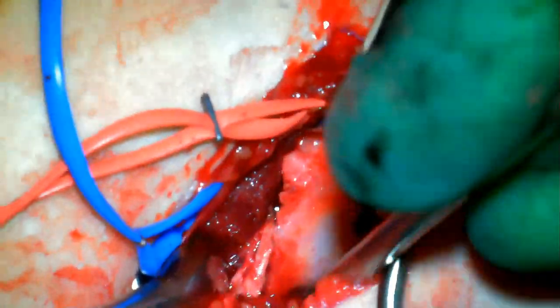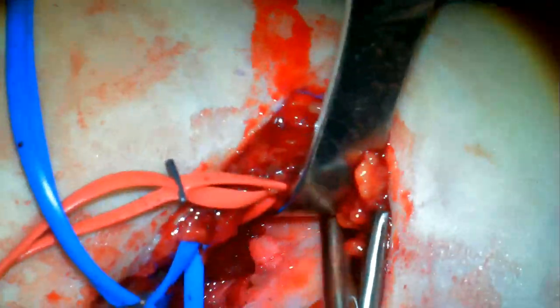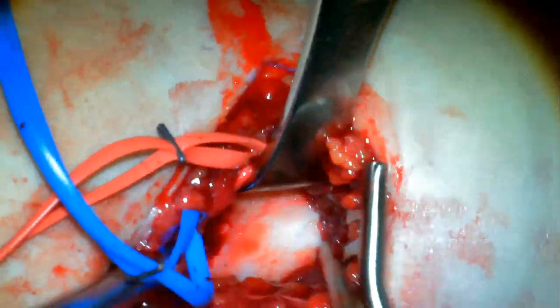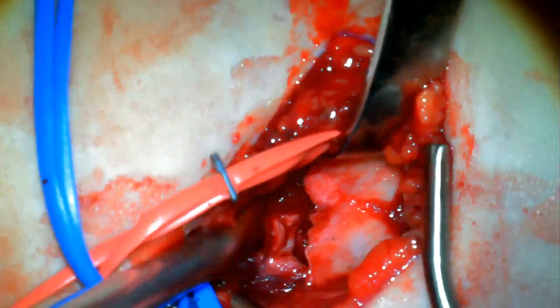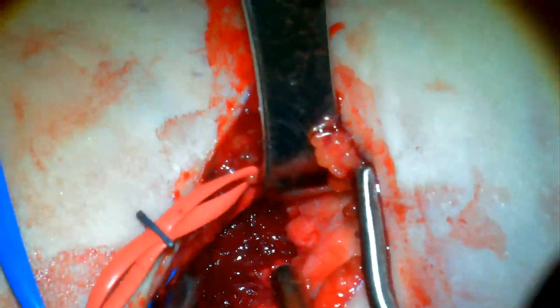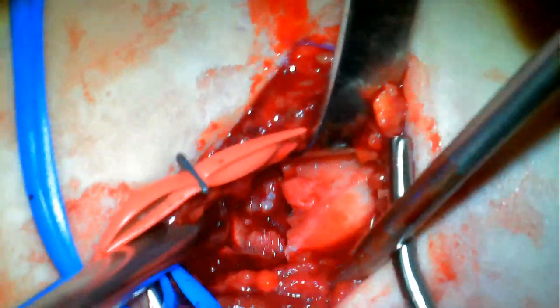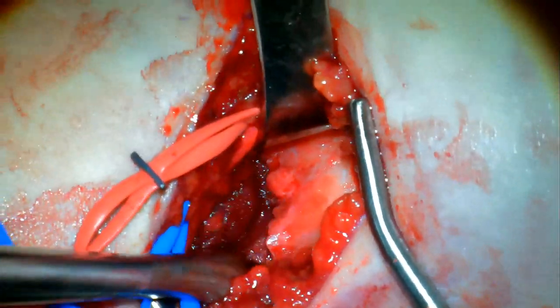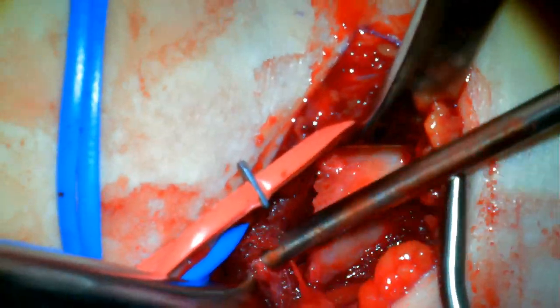We're now starting to see down into the fracture site. Here we can see the proximal spike. By using the cob, we can scrape on the distal fragment and scrape away any periosteum or muscle that's still interposed. Once we can flip that periosteum back and see some of the metaphyseal distal humerus, we know we've released enough. So now everything has been taken out of the fracture site.